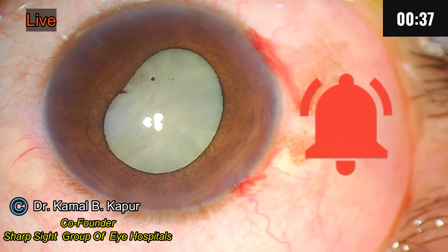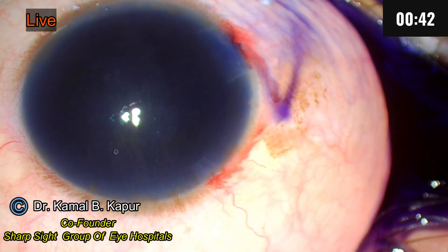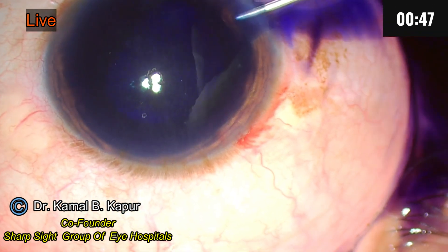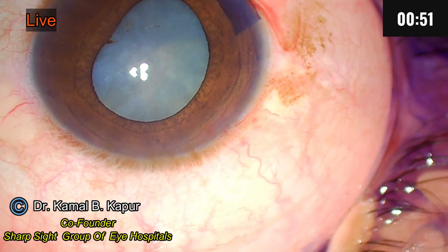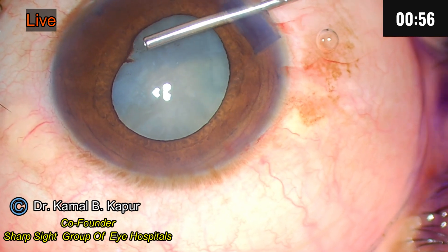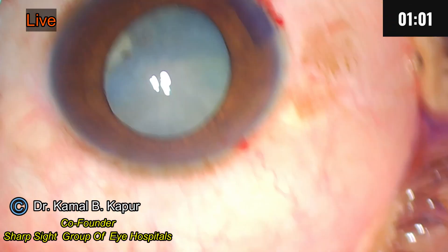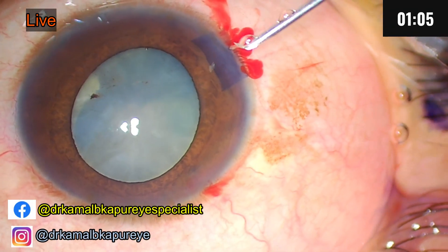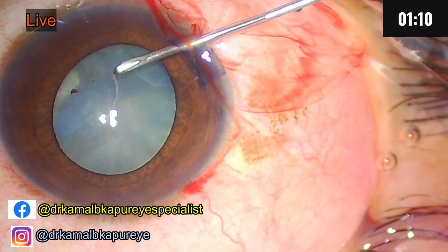We will now stain the cataract. The trick in these cases is to always make sure that your chamber is well inflated. The anterior chamber capsule is totally flattened, and the zonules in these cases are expected to be slightly weak.